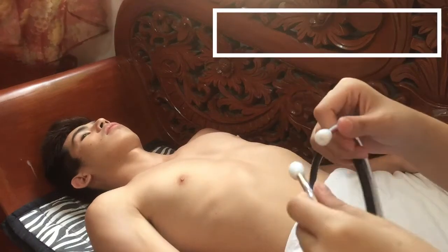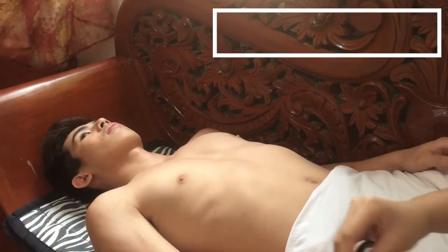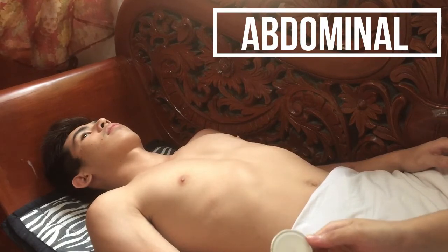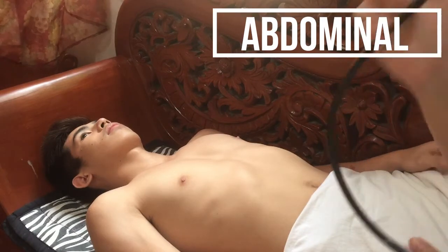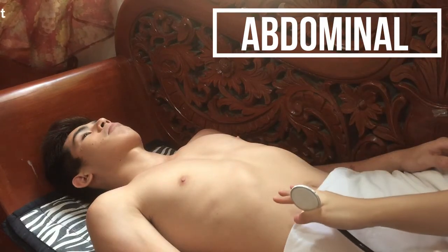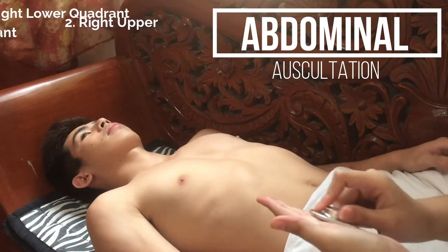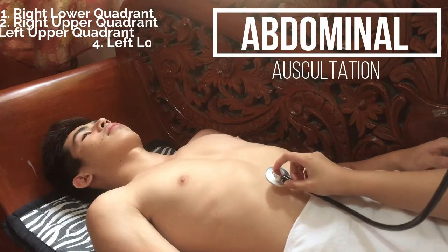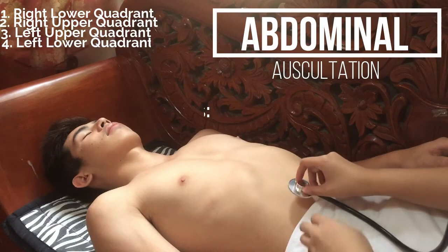We're now going to proceed to auscultate our patient first. We're going to auscultate first before we palpate and percuss so that we do not alter the bowel sounds. We're going to start at the right lower quadrant and go clockwise. So we're going to first warm our diaphragm. Marty, I'm going to put my stethoscope on you. I want you to just relax for me, okay? Okay, so we're going to start here.